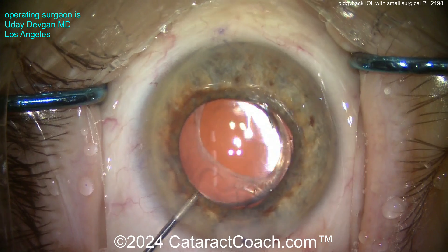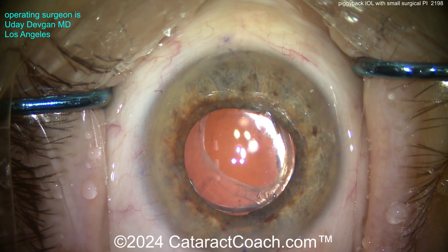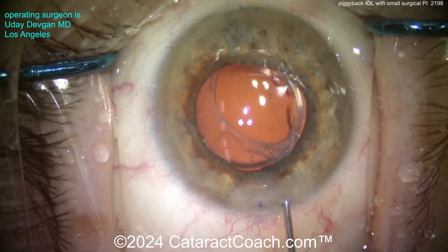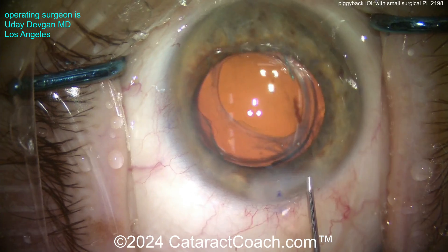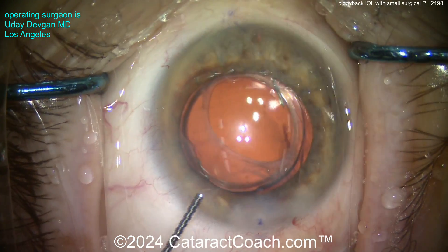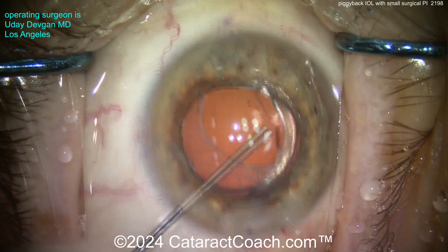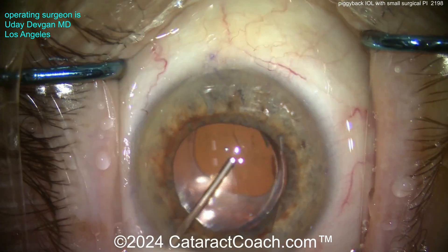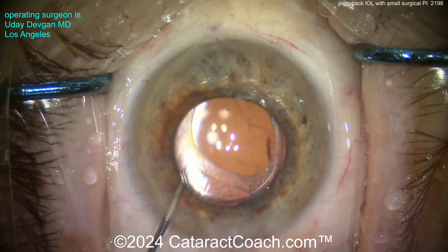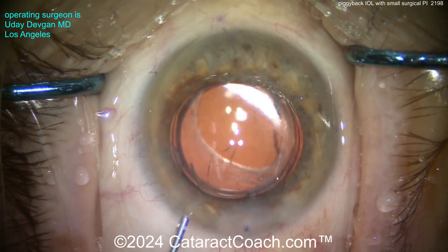The patient was very happy; calculations were spot on target. It's pretty easy to calculate for a routine eye — it's a multiple of the refraction at the spectacle plane. I went back and recalculated the original lens calculation powers just to confirm, and it calculates out the same way. This patient was very happy. The opposite eye underwent routine cataract surgery, and keeping in mind the patient's refractive goals and desires, the patient ended up with about the same refractive outcome in both eyes.